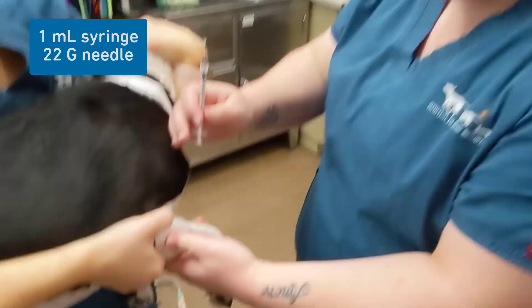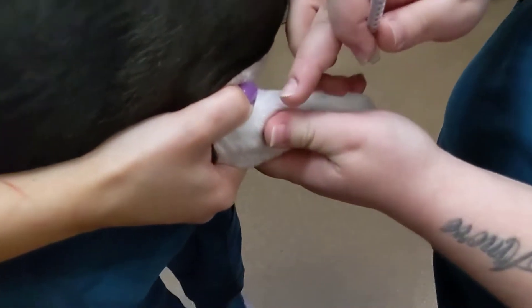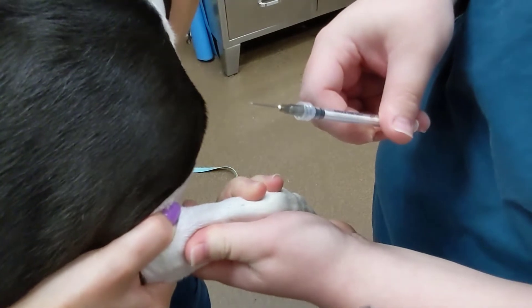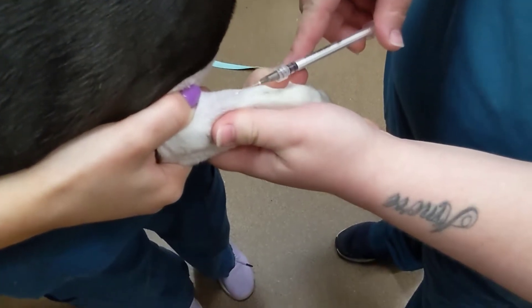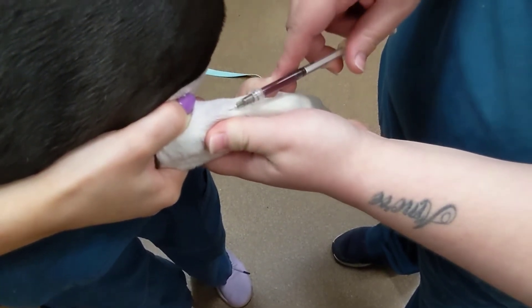I use my thumb to support the vein — bouncing right there. You always want it bevel up, so that point right there. Your entire goal is to stick it like you mean it, so when you go in bevel up, no hesitation — just like that.